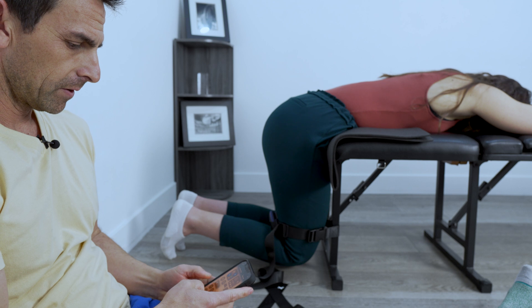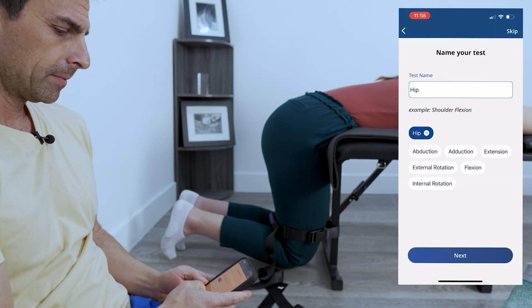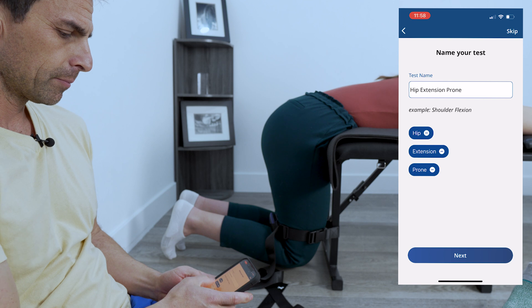So we're going to program this first. We're going to do the right side, hip, extension, prone.